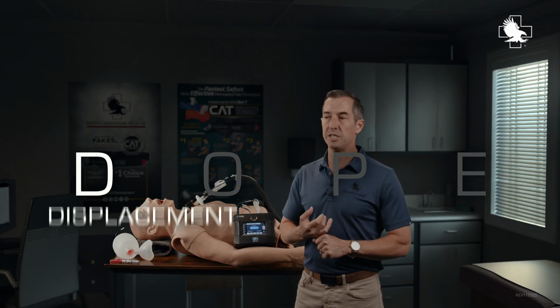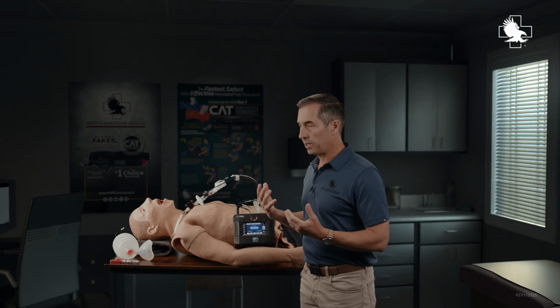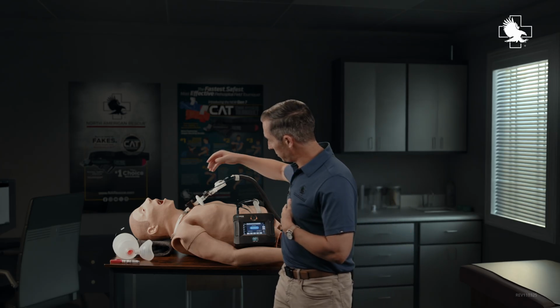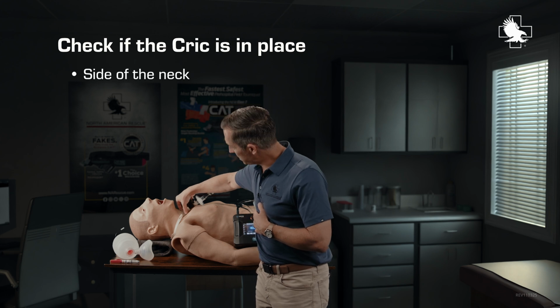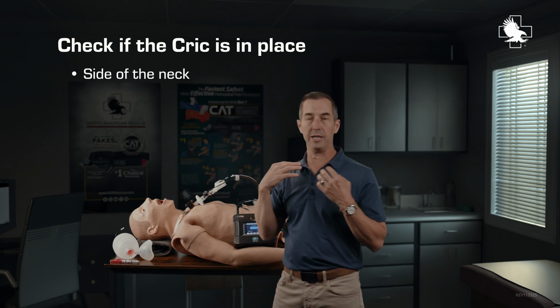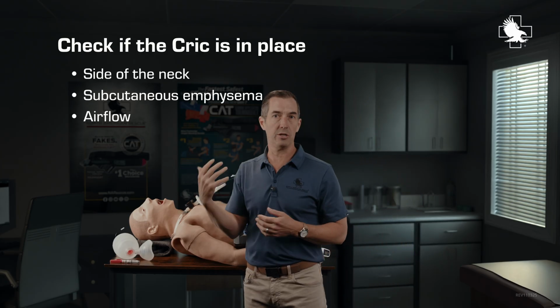D stands for displacement of the airway tube. So if I start getting hypoxic, D, I'm going to first take a look and make sure that my crike is in place, right? So I'm going to check the side of the neck. I'm going to make sure I'm not getting any subcutaneous emphysema. I'm going to make sure that it looks like air is going in and out.